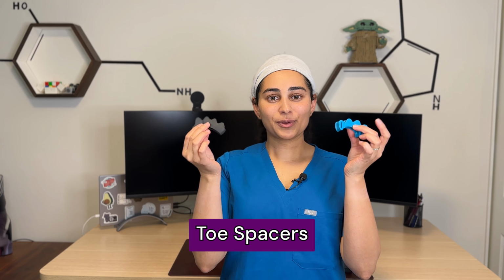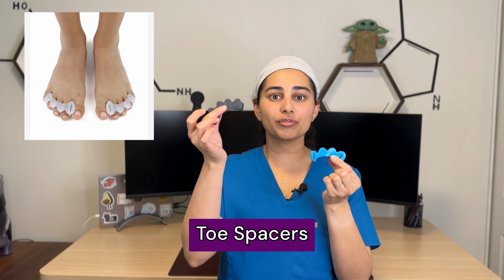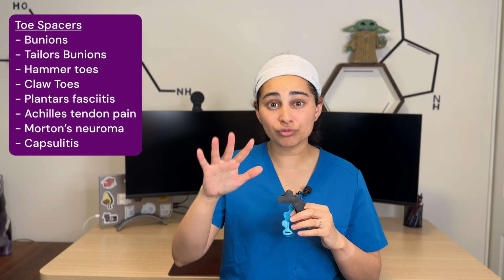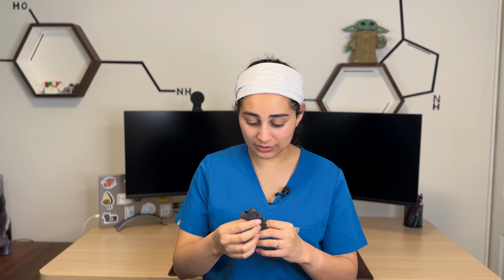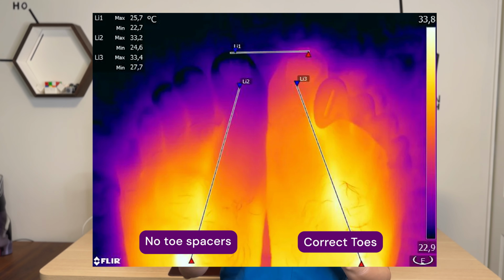Now let's move on to the foot. So let's move on to toe spacers. You've got the Correct Toes, which is a branded version of toe spacers, and then you can get these no-name silicone versions as well. What are these used for? These are really helpful for those with hammer toes, squish toes, bunions, tailor's bunions. There's a lot of evidence coming out saying that our ability to splay our toes increases blood flow to the entirety of the foot, helping us to stabilize better, to create better tissue, to reduce plantar fasciitis, to reduce Achilles tendinosis, and these can be quite effective.